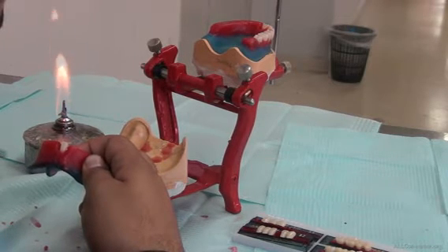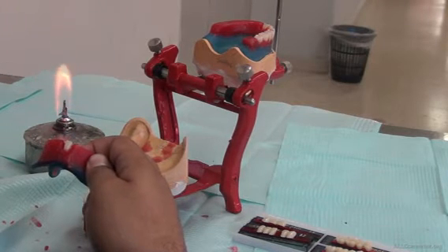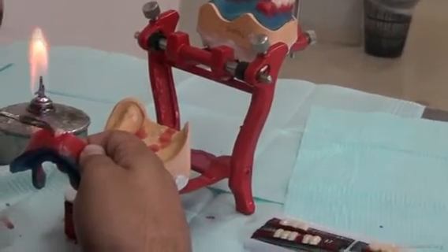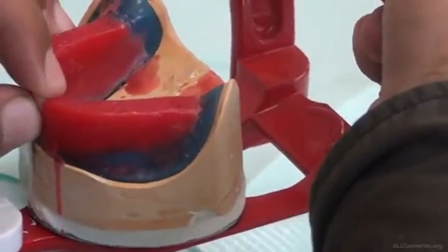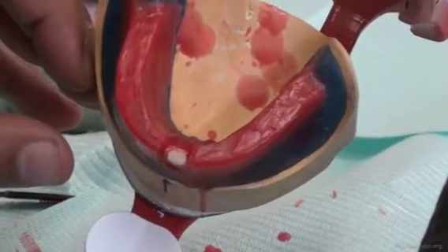Now, if we place the tooth exactly on the wax rim height, we will not get an overbite. We create overbite by having the tooth set into location a bit higher than the wax rim itself. When each tooth is added, we make sure that we have its angulation correct from the beginning, so as not to do a lot of adjustments. The root of the lower is tilted to the inside, and the incisal edge is to the outside, so we just press on the root area. We make sure that the inclination of the tooth is correct, and now we can compare it with the upper teeth.